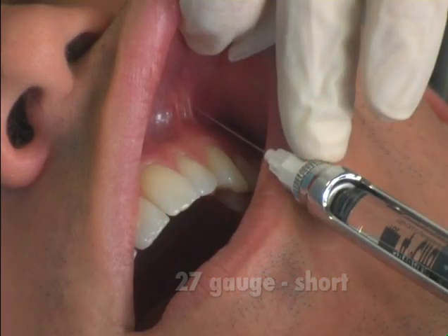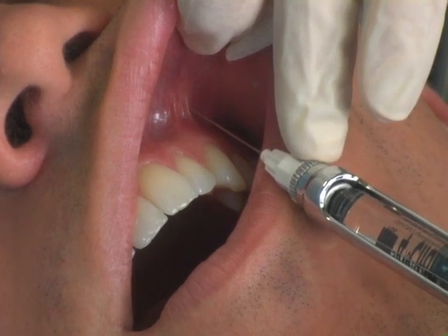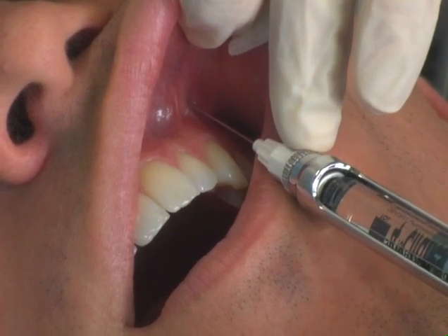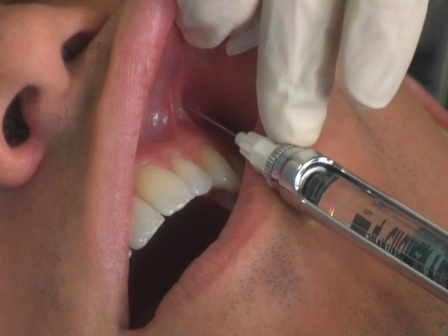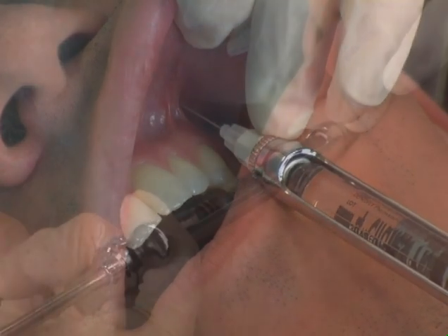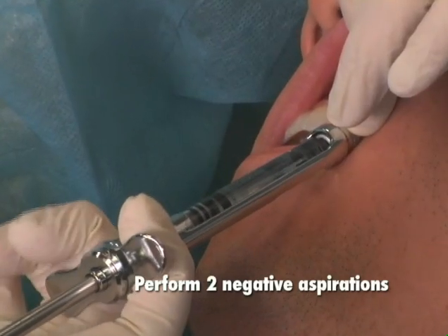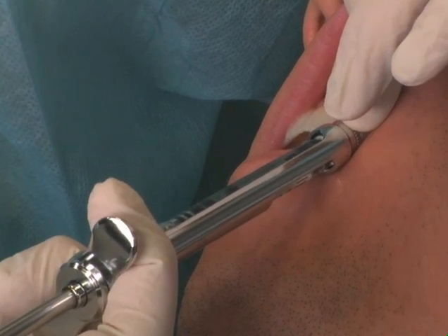The insertion site is in the height of the mucobuccal fold over the apex of the anesthetized tooth. The needle is held parallel to the maxillary bone and inserted until the needle tip is at or above the apex of the tooth. After 2 negative aspirations, 1/3 of a cartridge of local anesthetic is slowly injected.